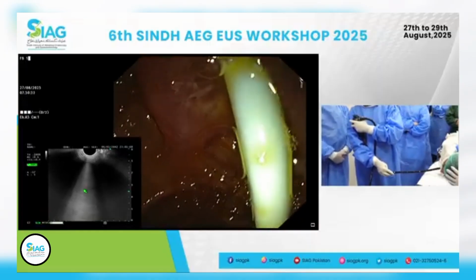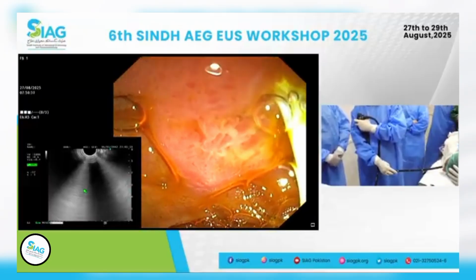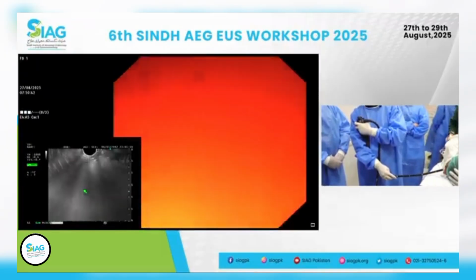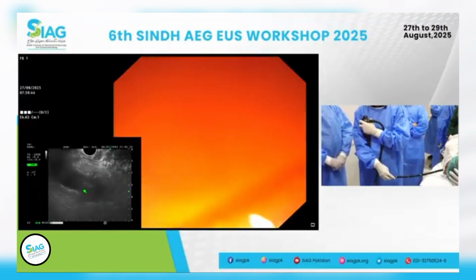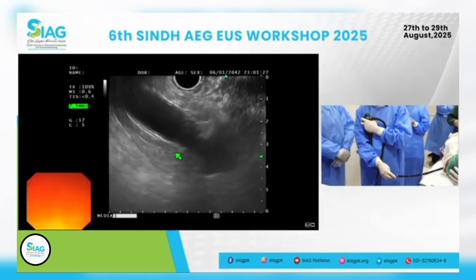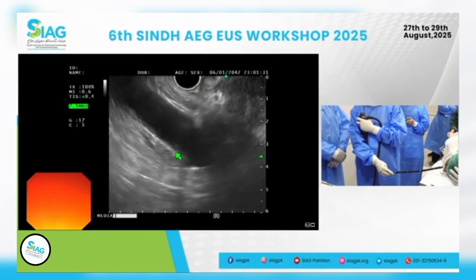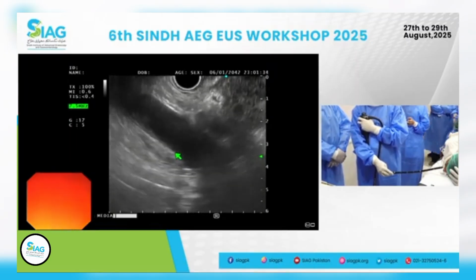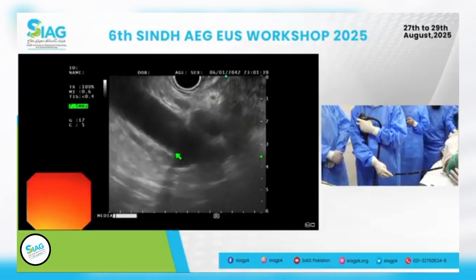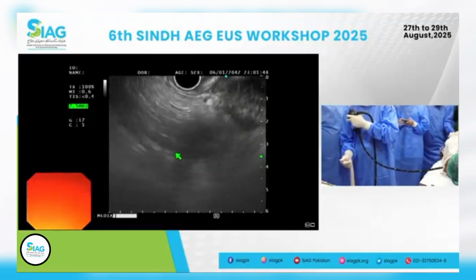That's where my papilla is. I will get my papilla. I got the transducer to the left of that stent. Suction that. My transducer is a couple of centimeters from the papilla. Rotate to the right and left, and pull the scope a little bit back. My goal is to get the aorta in this position, which is on the left side of the transducer and in the landing position. Now scope is very straight right here.